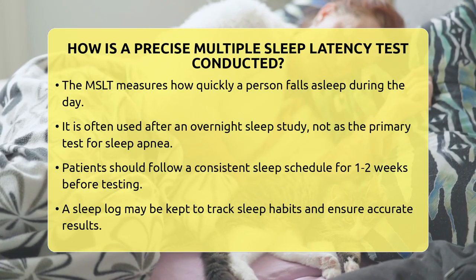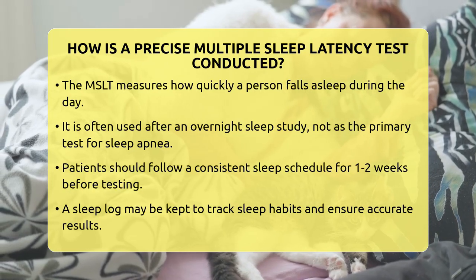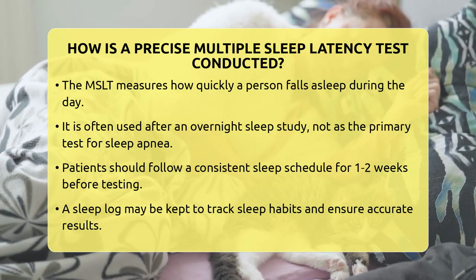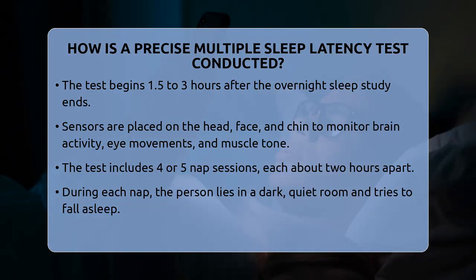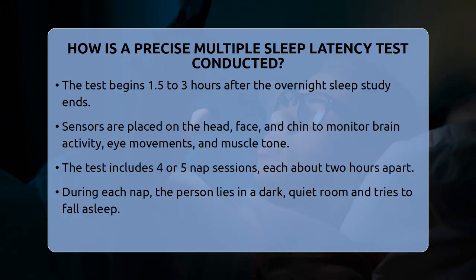Before the test, patients usually follow a regular sleep schedule for 1 to 2 weeks. They might keep a sleep log to track their sleep habits. This helps make sure the test results are accurate and not affected by irregular sleep or sleep deprivation.